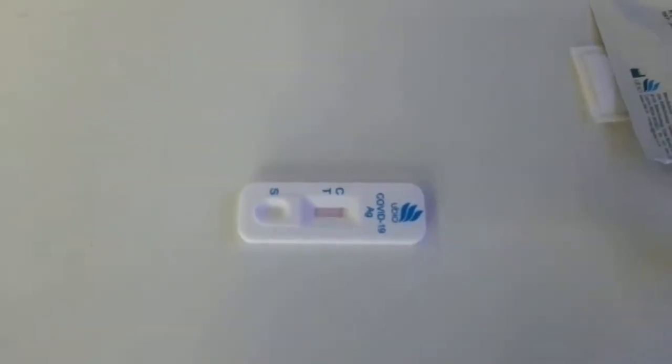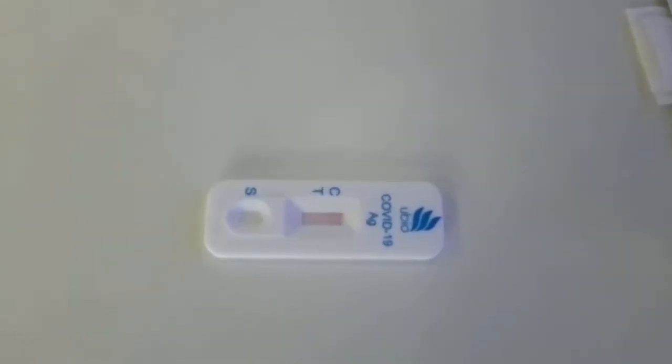Color bands at both positions, control line C and test line T, indicate that coronavirus antigen has been detected and the result is positive for antigen.